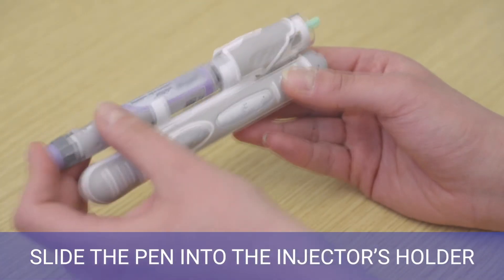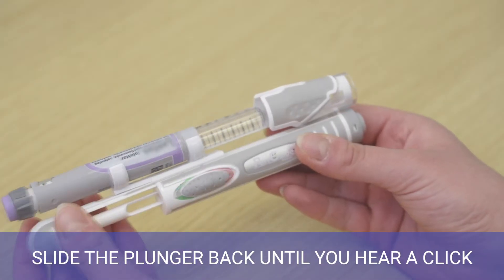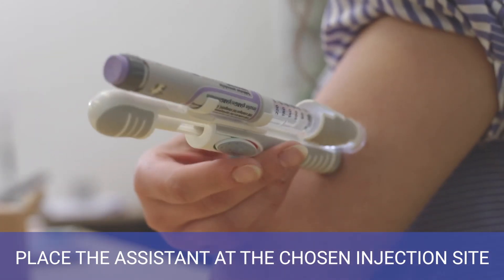Slide the pen into the injector's holder. Remove the inner needle cap. Slide the plunger back until you hear a click. Place the assistant at the chosen injection site.